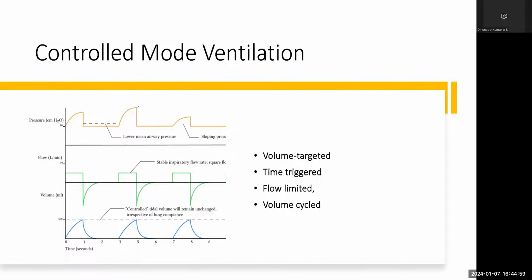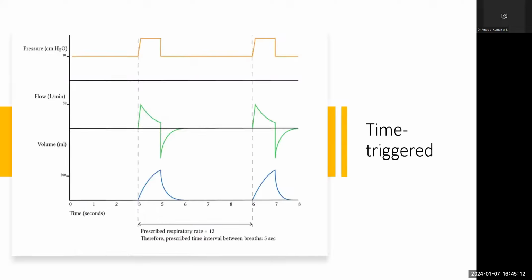So coming to the controlled mode of ventilation, I've already told it can be volume targeted, time triggered, flow limited, and flow cycled or volume cycled. So we are not going to discuss this one because we are not at all using the control mode. I've already told that.